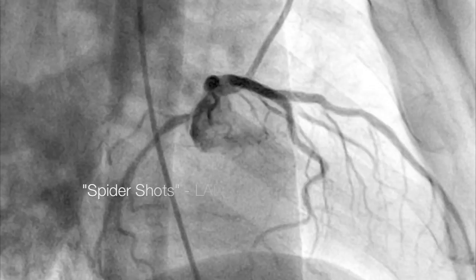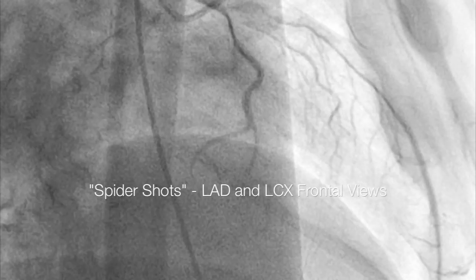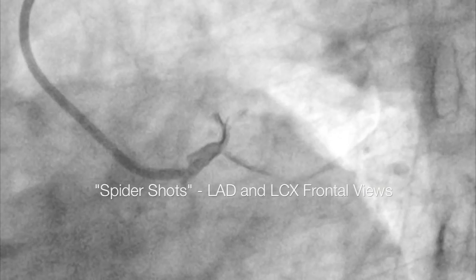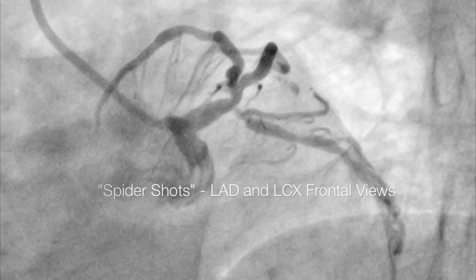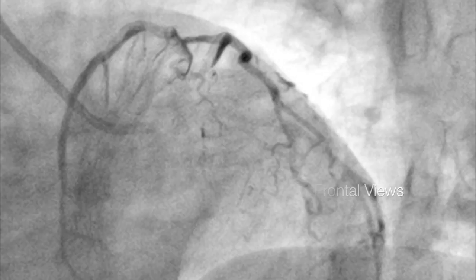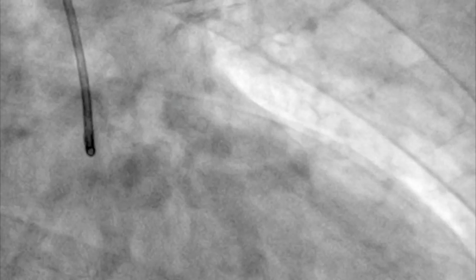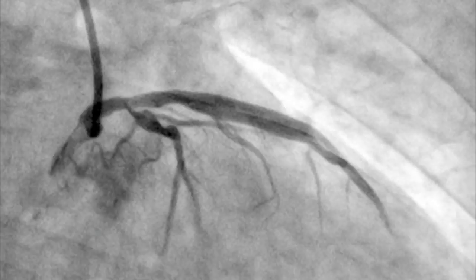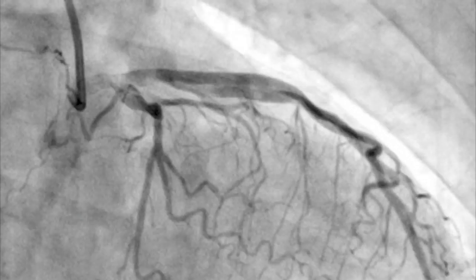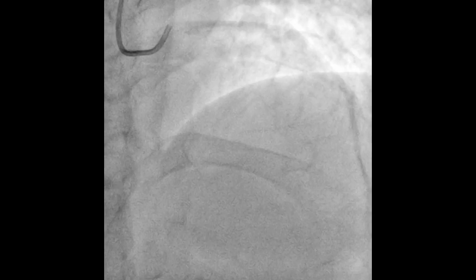Here is a spider shot video recording of the LAD and the LCX. A spider shot is a front view of the heart. You can still see how thin the LCX is — it's on the right-hand side.